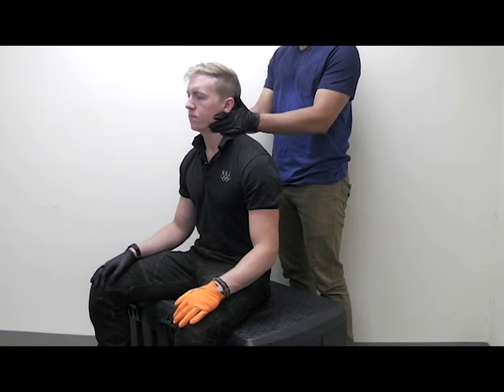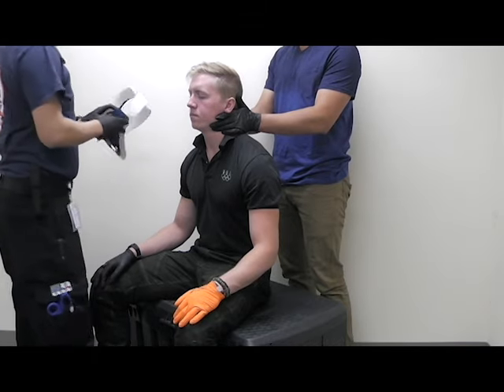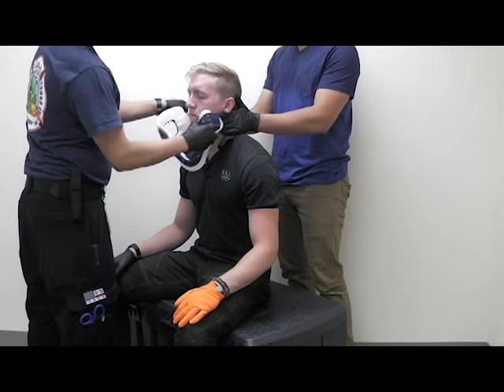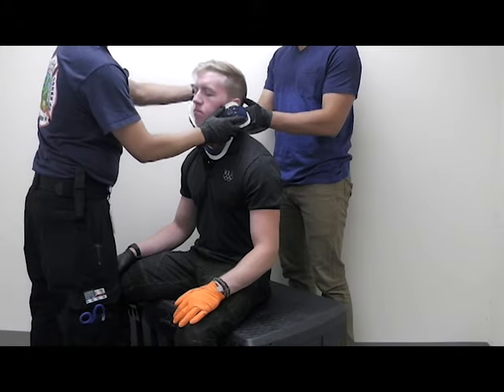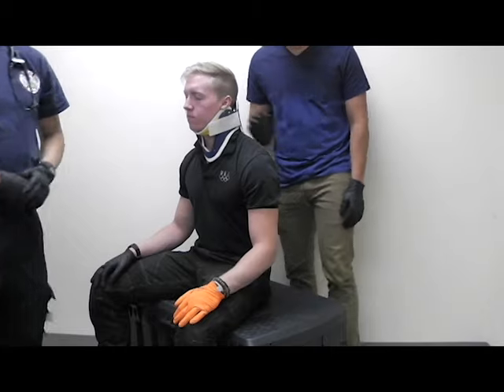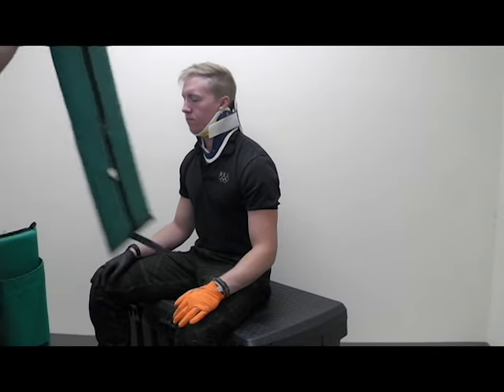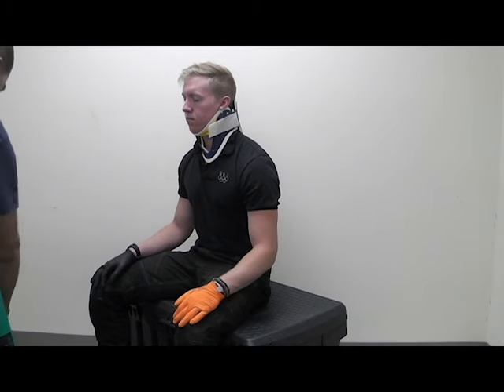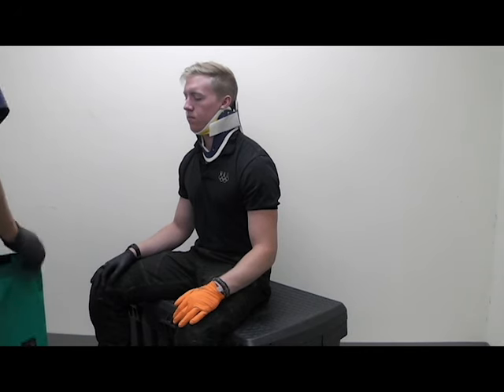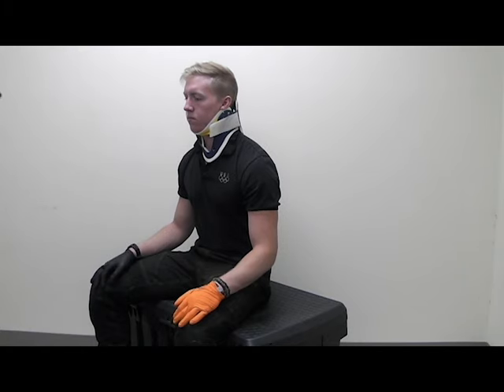Once my partner has started manual stabilization, I'll grab a C-collar and apply it using the correct methods. I'll have my partner slide that way and apply the C-collar. At that point, I'm then going to take my KED out. Make sure you have all the straps that you need.